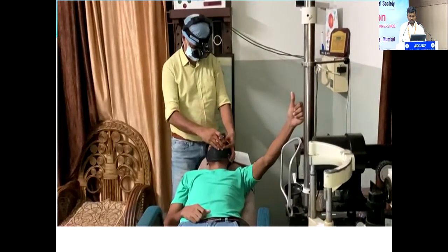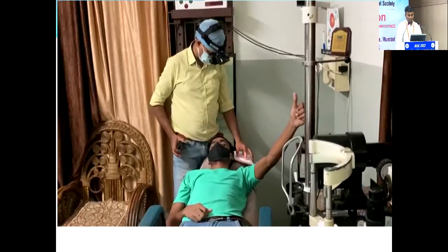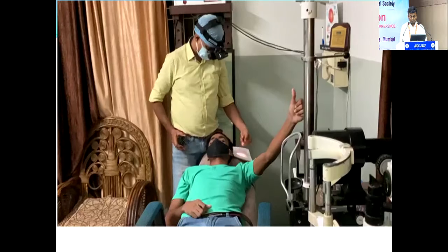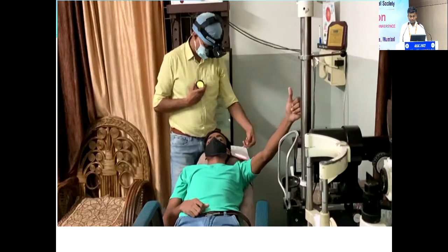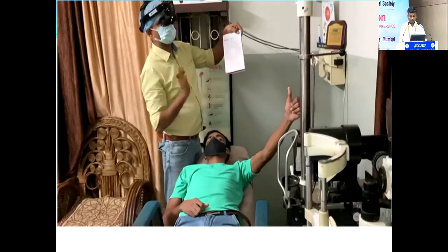You are seeing this, this is the 5 o'clock position. You just see where the 5 o'clock position is, and whatever you see near to you, draw near to you, and what is far off from you, draw it far off from yourself. When you place it properly, you will see it is properly aligned.